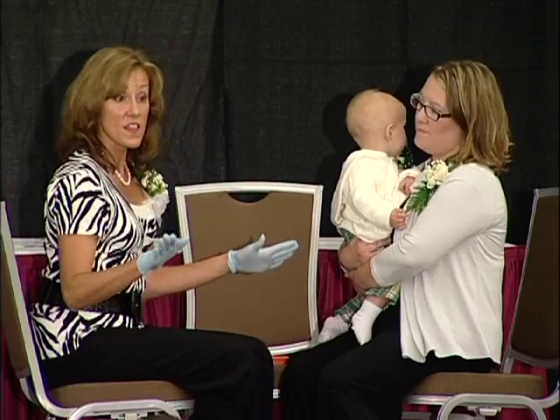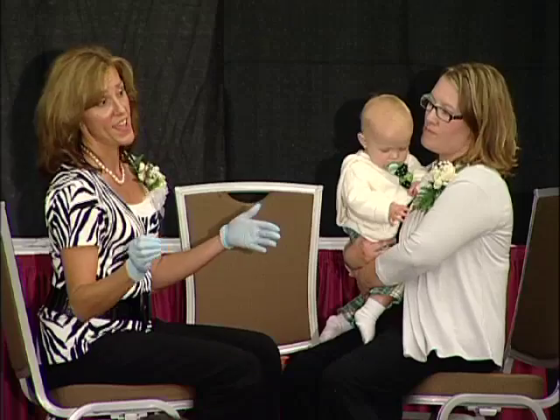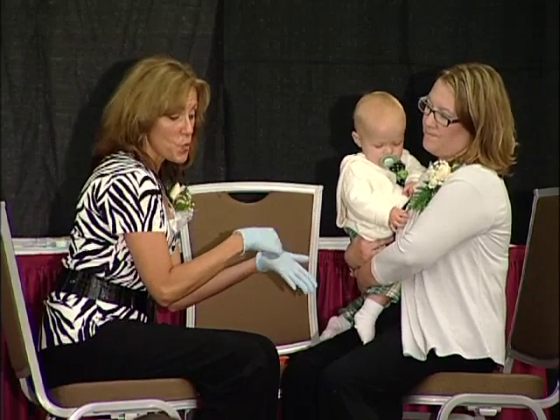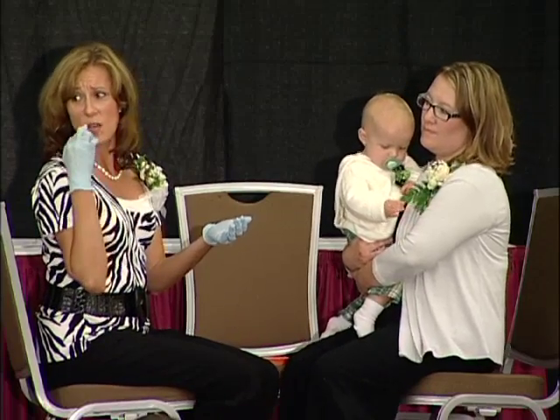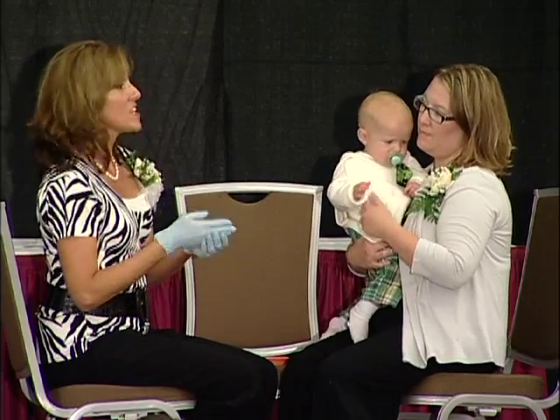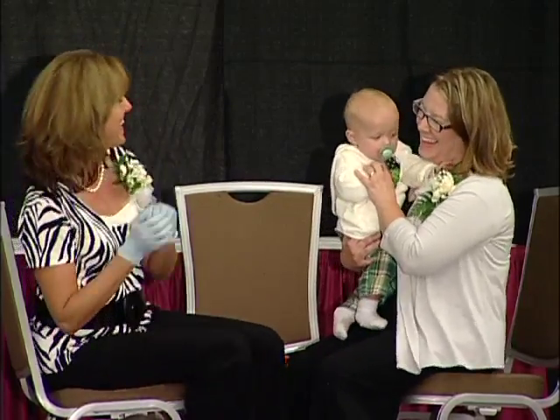And then at the very last part, after the doctor has already looked, because it can hinder your view of things, you get in there and you're going to rub it all over. I smooth it out with my fingertips just so it doesn't look so chunky and bumpy. And then they're done. They get drinks of water afterwards if they want anything to drink.